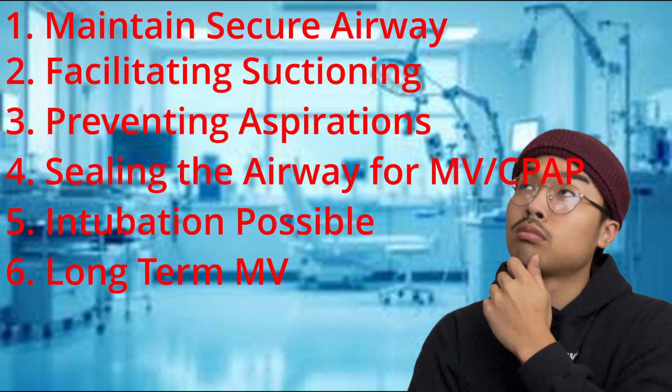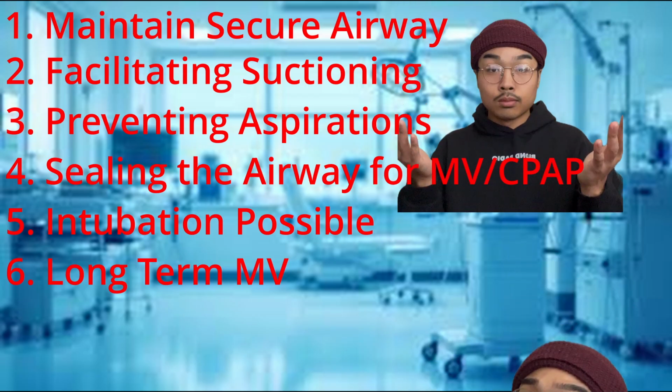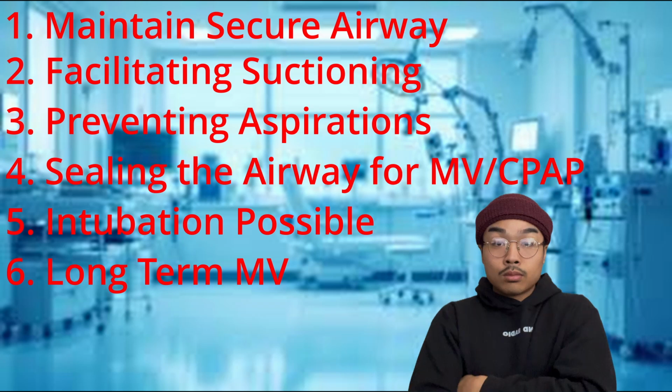Other indications would be facilitating suctioning, preventing aspirations, sealing the airway for mechanical ventilation or CPAP. This also makes intubation possible for some patients that previously weren't able because of something like a spinal cord injury or trauma. Lastly, long term mechanical ventilation.